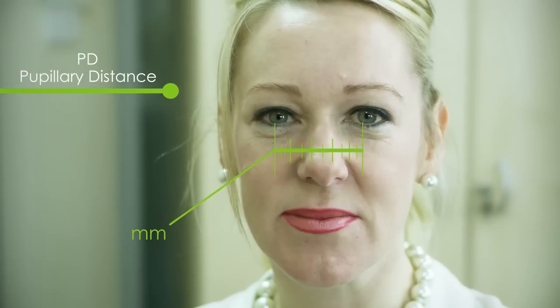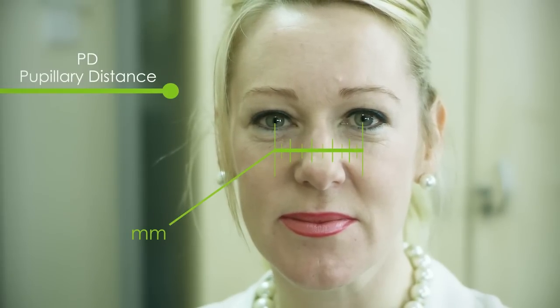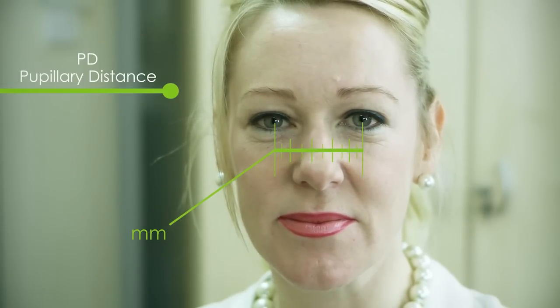The PD or Pupillary Distance is the distance between your pupils measured in millimeters. This measurement ensures your prescription lenses are correctly centered in front of your eyes when purchasing new glasses.